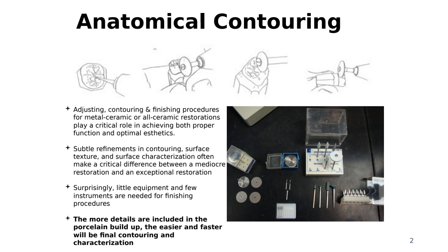The more details are included in the porcelain build-up, the easier and faster the final contouring and characterization will be. And this is exactly what I was telling you. When we do the build-up in porcelain, instead of just throwing a lot of porcelain there and making a big block and then grinding it down to shape, it's better to build up little by little and keep in mind the shape that you need. It's much easier to work that way.